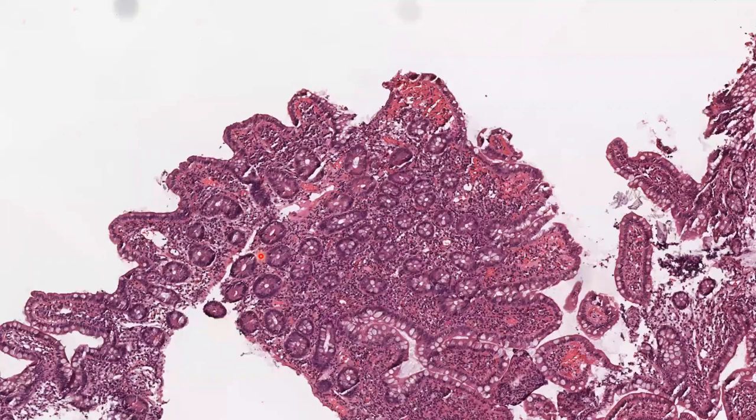Okay, so we move on. Here in this part of the biopsies, there was a lot of blunting of these villi. If I tell you there is an increase in chronic inflammatory cells because you've lost the gradients completely, you probably agree. If I ask you, do you have a crypt architectural distortion, which is the important question here, do you really have it, or do you have some hyperplasia of the crypt? Another thing is that when you get adaptive changes, the crypts become very hyperplastic, and when they become very hyperplastic, they start to branch with a lot of complexity, and that can give you a false impression of architectural distortion.